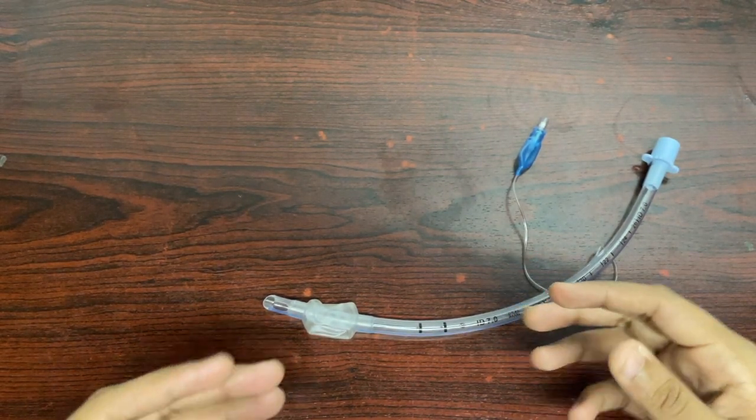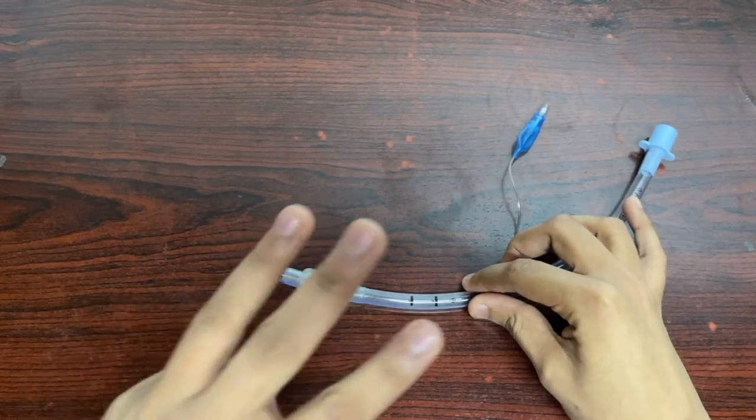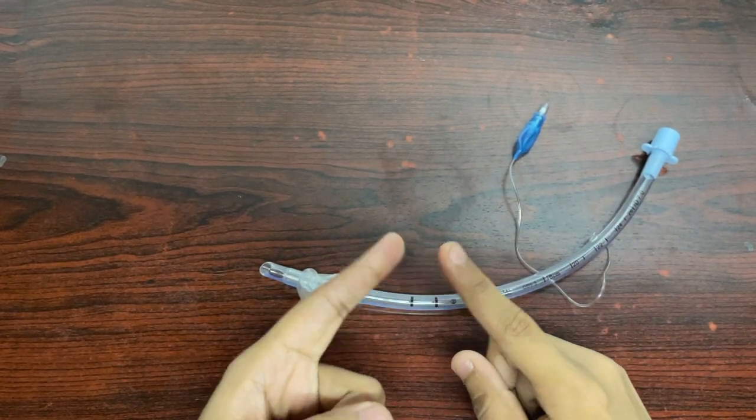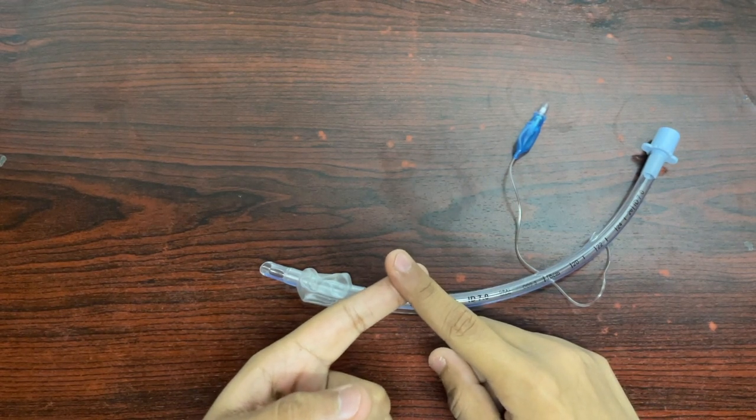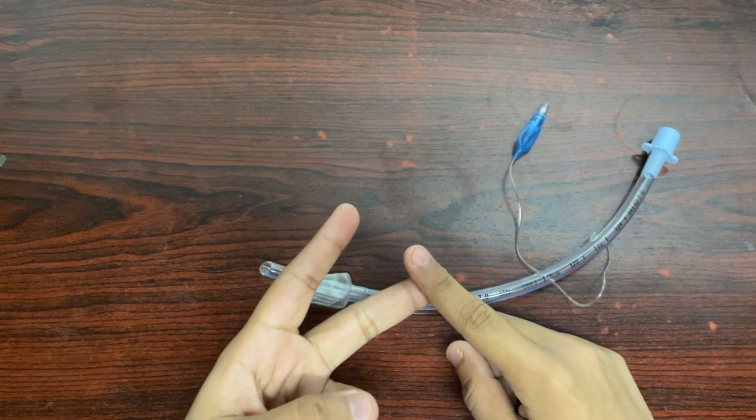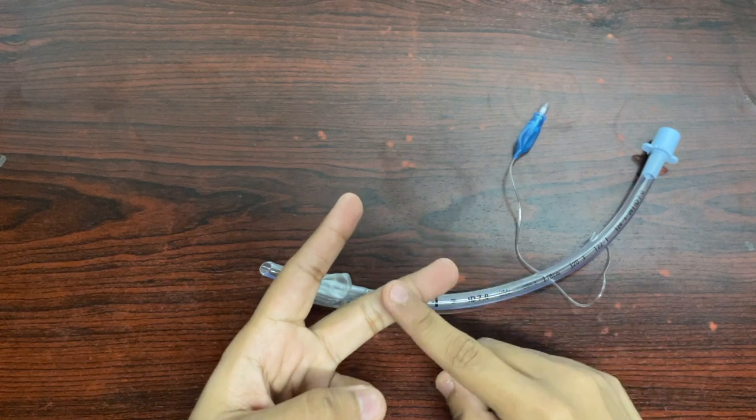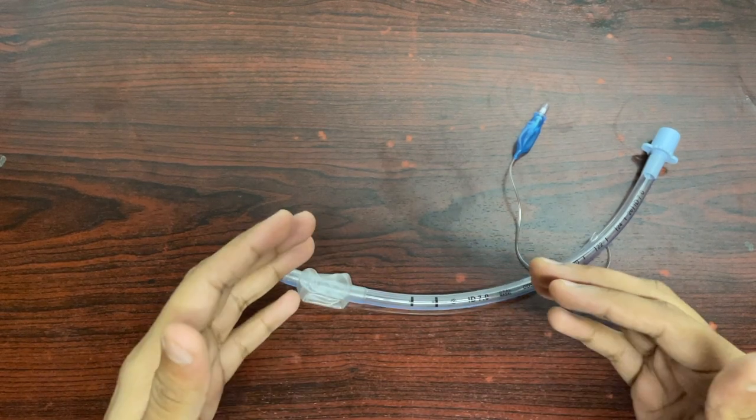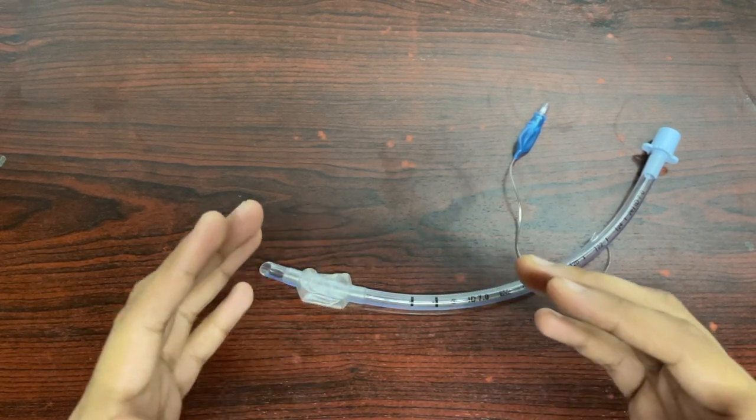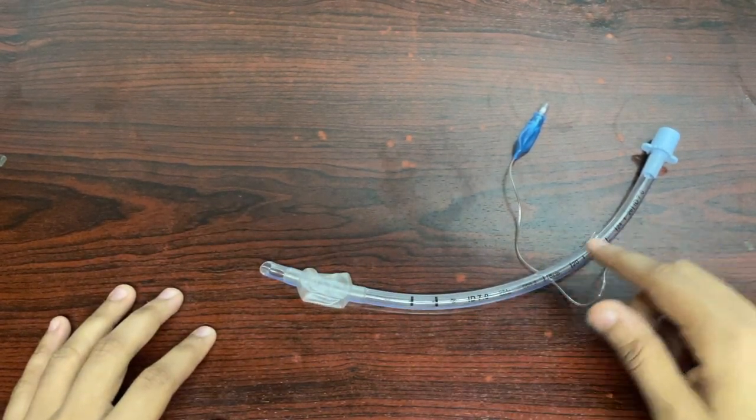The cuff of the endotracheal tube has three main advantages. First, it will prevent any sort of fluid aspiration through the trachea. Second, it will prevent any form of gaseous leakage through the main endotracheal tube. And third, it is specifically designed to maintain the position of the endotracheal tube in the trachea.